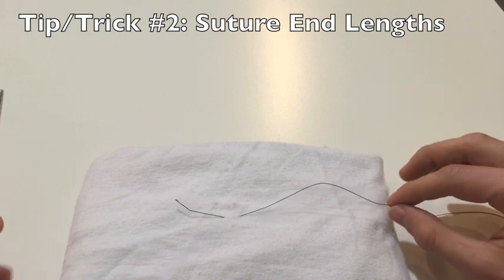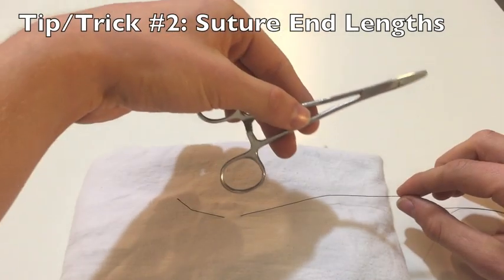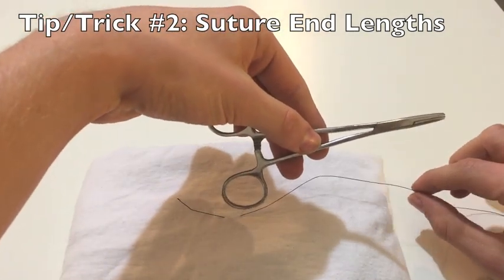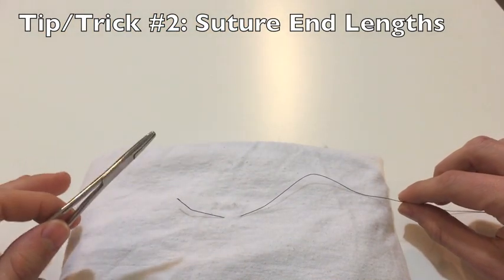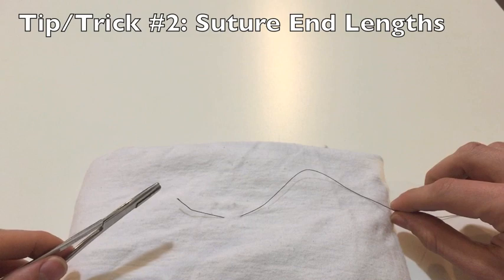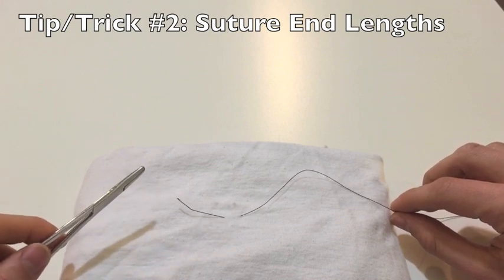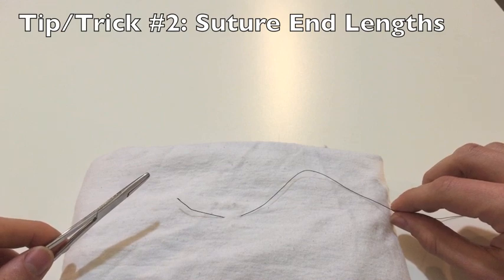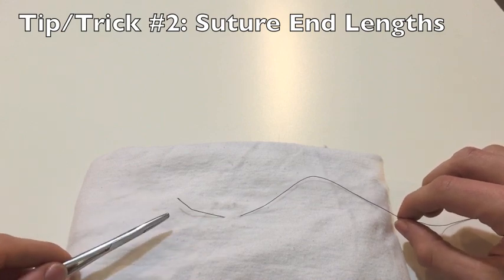On the other end — the needle end — I make sure that I grab back around the length of my needle driver. This is around the ideal length for me to be able to wrap my suture around my needle driver. Any shorter or any longer makes it just a little bit more difficult. And so that's my second tip: the lengths of each end of the suture.